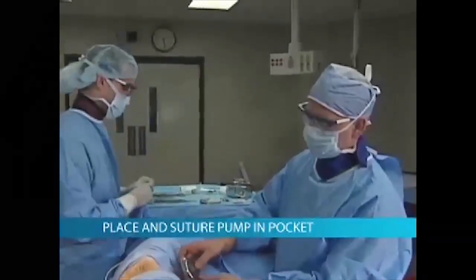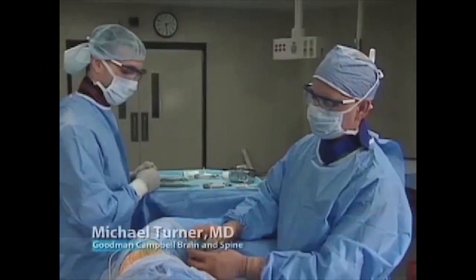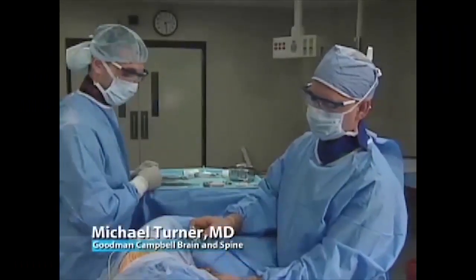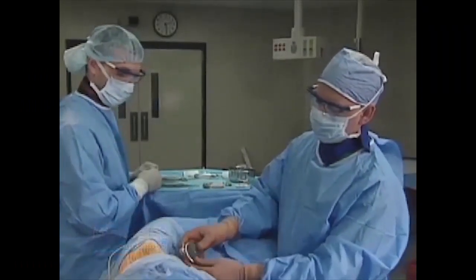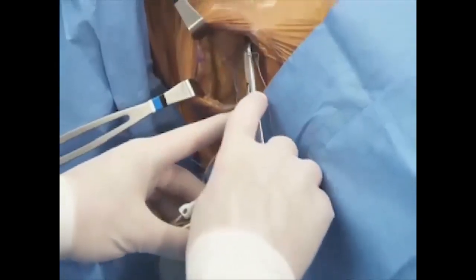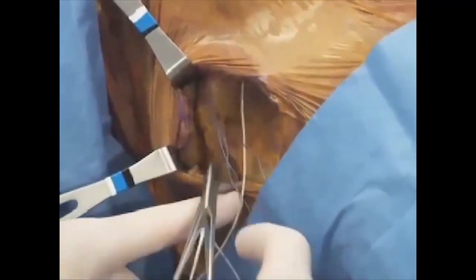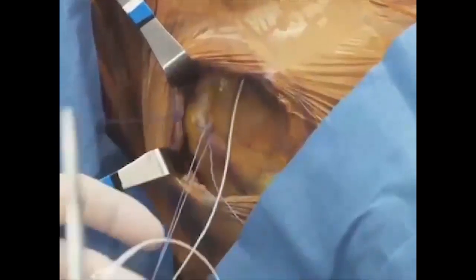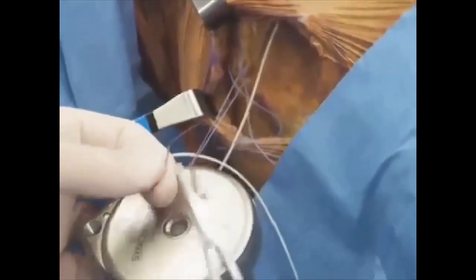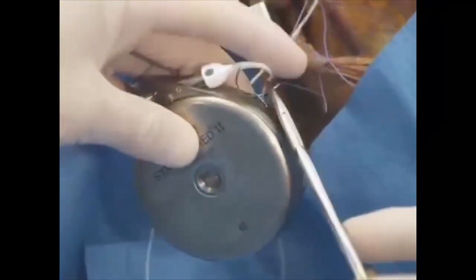When positioning the pump in the pocket, again, the side port, you want to make sure the side port does not rub against the iliac crest, the rib cage, and I tend to therefore rotate it in towards the midline. Set 2 heavy, non-absorbable sutures in the fascia. The location of the sutures should roughly correspond to the location of the suture loops on the pump's perimeter. Pull one suture through each of the suture loops, and draw the pump into the pocket and tie the sutures.